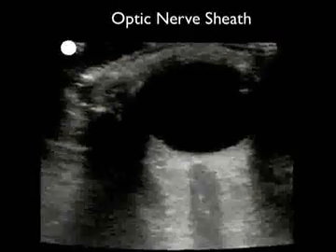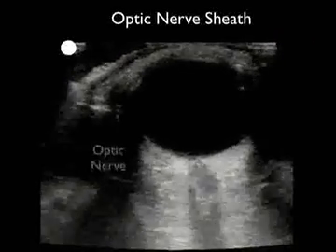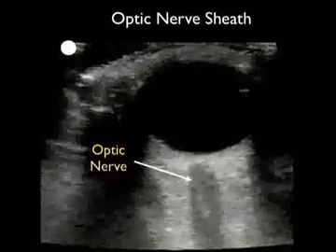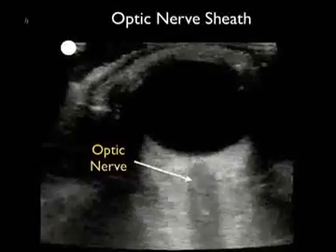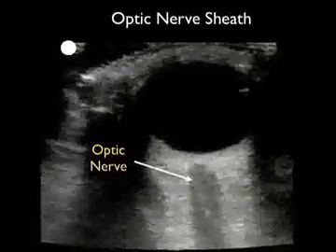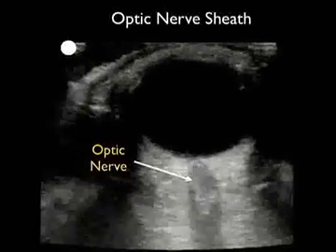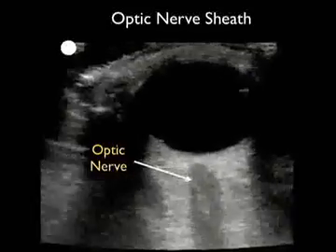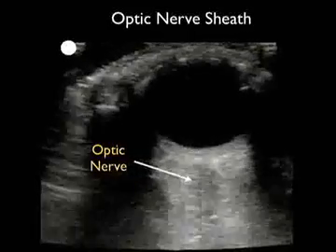Now if we have the probe in a side-to-side or transverse orientation across the eye with probe marker lateral, and we aim the probe a little bit more inferiorly down towards the patient's foot, the optic nerve sheath will come into view. Note the optic nerve has a classic appearance on bedside ultrasound — it's dark or hypoechoic — and we can see it leading right up to the back of the eye.